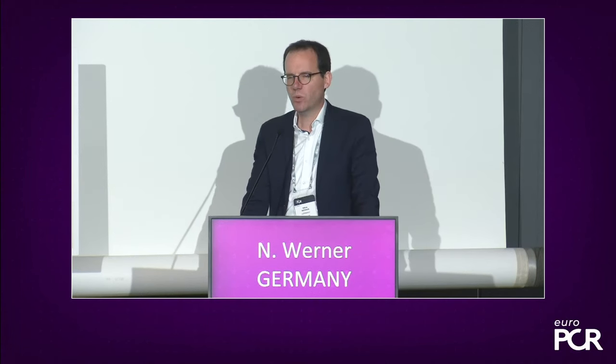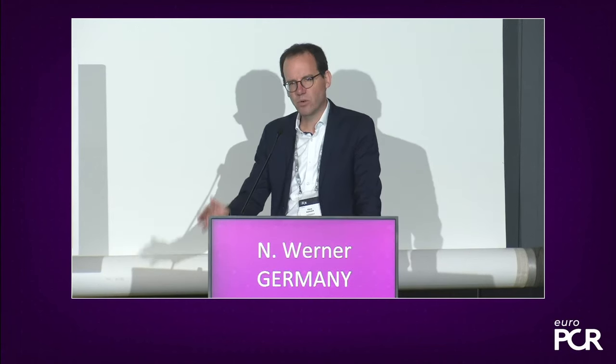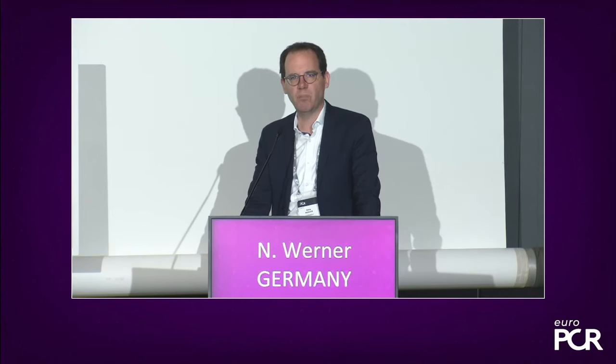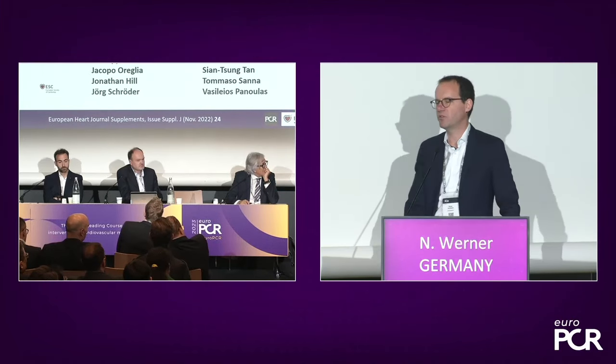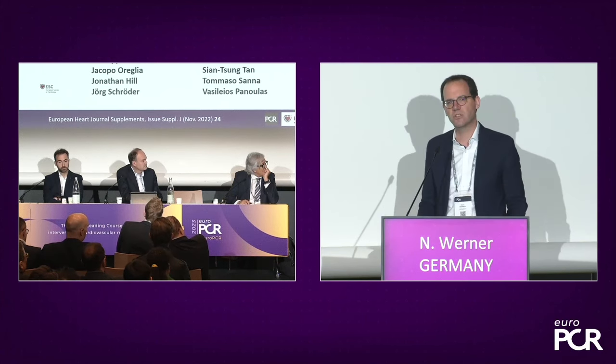So what we do after the procedure is that we quite slowly decrease the unloading. So we go stepwise down with the amount of unloading, and we very closely monitor things like LVEDP, for example, and blood pressure. These are the two main parameters we monitor. And if we see that LVEDP remains stable and the patient's hemodynamics remain stable, in some situations you may also have a right heart catheter in the patient, so this depends.